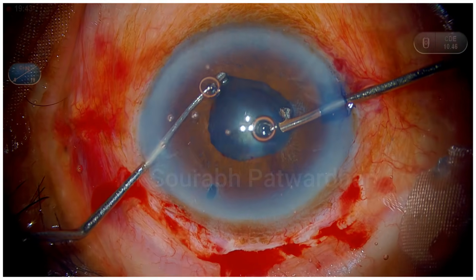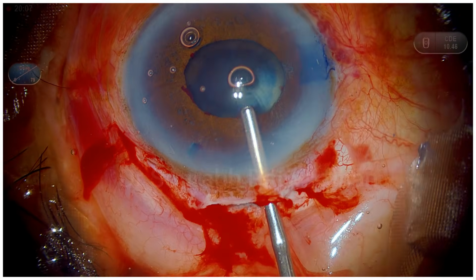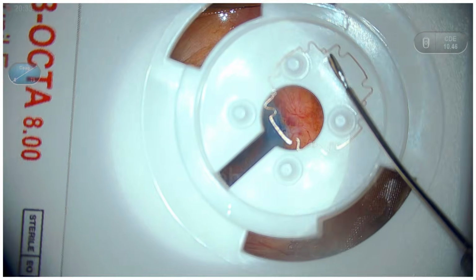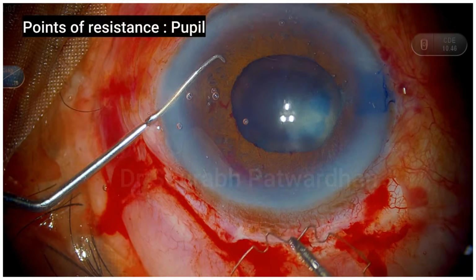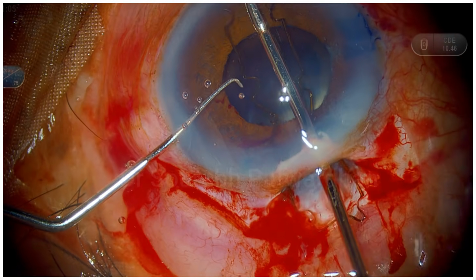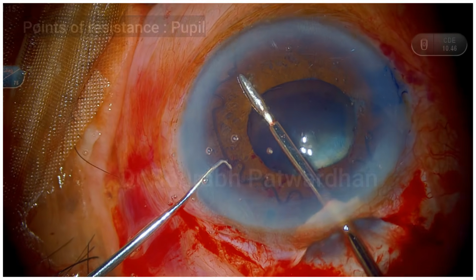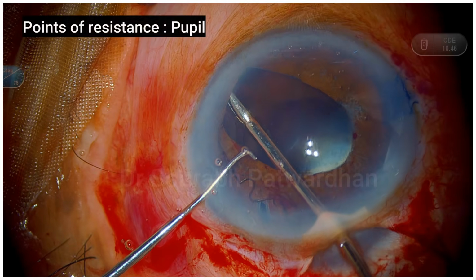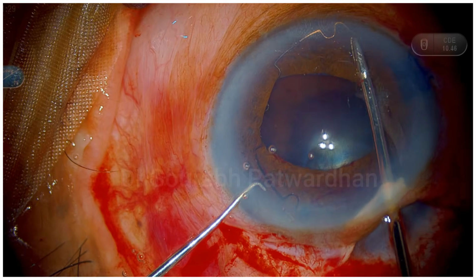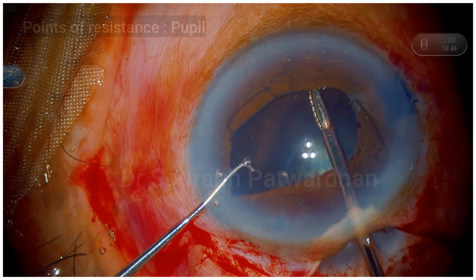Now because it's a kind of a fibrotic pupil, I am going to use these two Utrata hooks to stretch the pupil further, and I am going to use B Octa, which is an 8 millimeter pupil expander by Dr. Suven Bhattacharjee. So this goes through that 2.8 entry that I have made, and I am using the B Octa forceps. So always remember that there are three places of resistance when you are doing manual SICS. So here I am going to tackle the first point of resistance, which is the pupil.